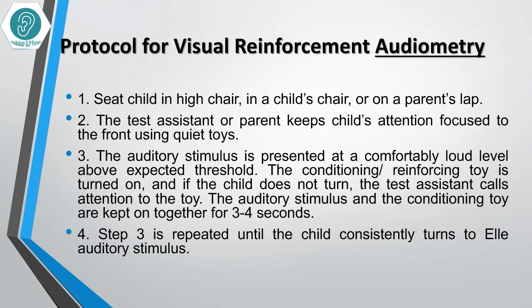Protocol for Visual Reinforcement Audiometry: First, seat the child in a high chair, a child's chair, or on the parent's lap. Second, the test assistant or parent keeps the child's attention focused to the front using quiet toys. Third, the auditory stimulus is presented at a comfortably loud level above expected threshold.